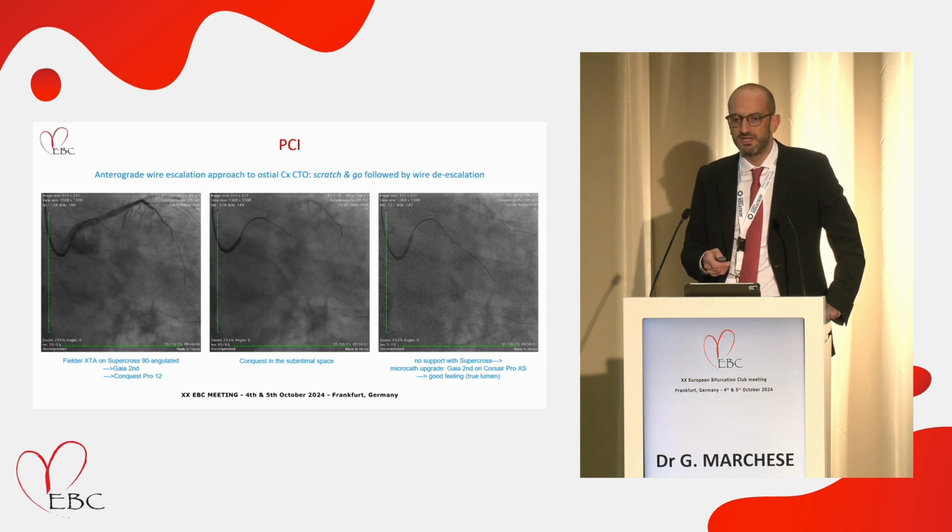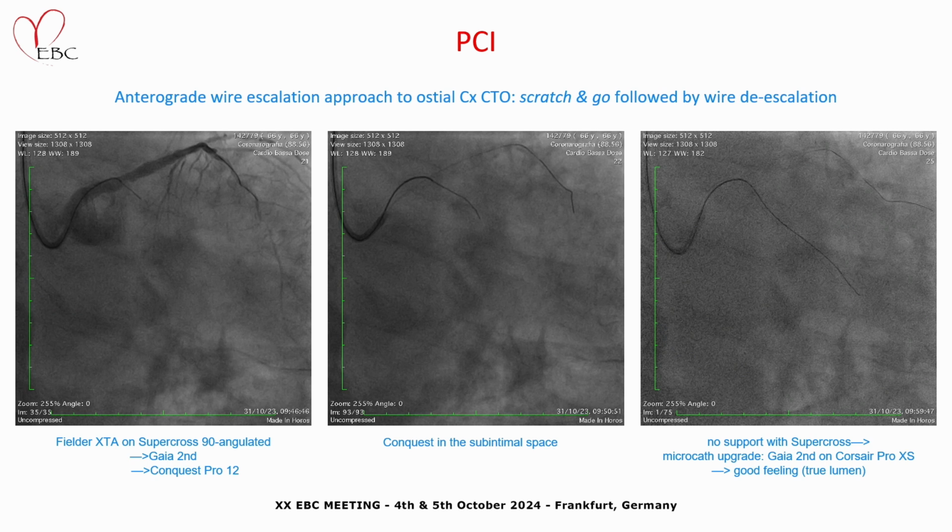So we went back. As you can see from this last video, the support is really bad, not really a good support. So we decided to upgrade the microcatheter, passing on Corsair Pro XS, and de-escalate to Gaia Second wire.